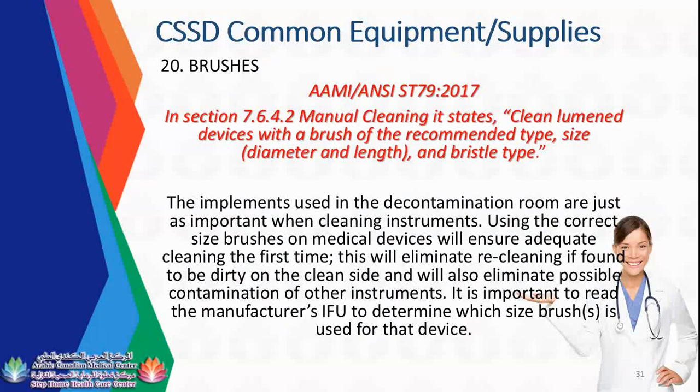So using the correct size brushes on medical devices will ensure adequate cleaning of the instruments. This will eliminate re-cleaning if found to be dirty. Re-cleaning, guys, because once you see in the magnifying glass that there's still blood, you need to send it back to the brushing area or the contamination area.